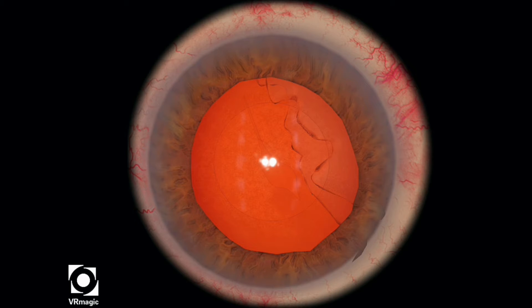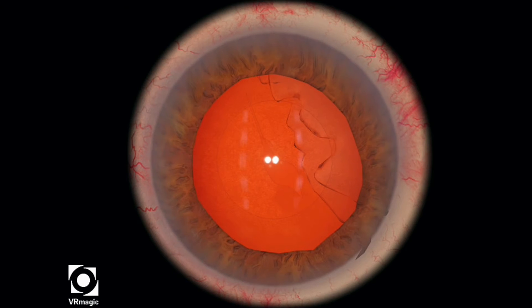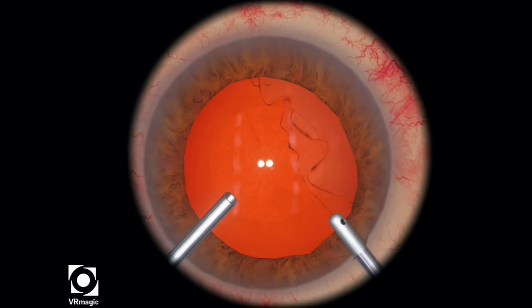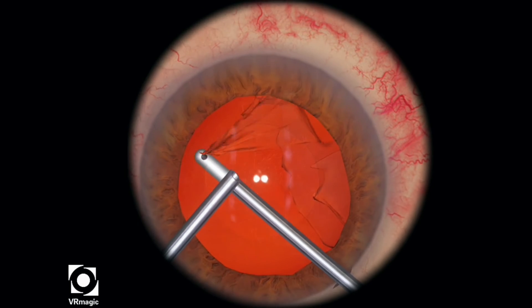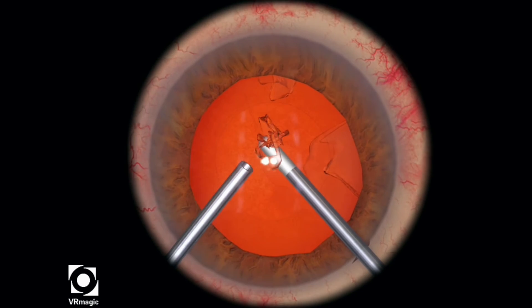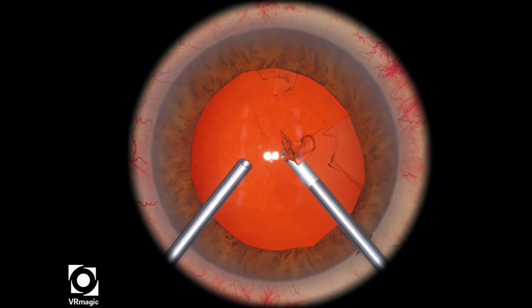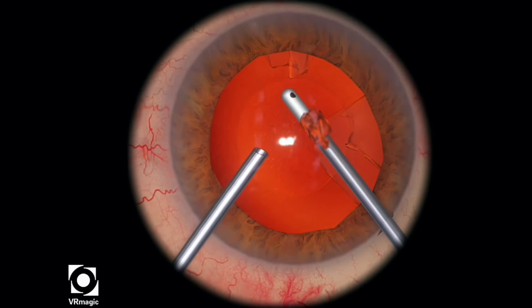Now I'm just adjusting my OR machine settings. I prefer to have a bi-manual irrigation aspiration tool for this particular level. I know in certain institutions you may not have this particular device available to you, so you can try it with a 45 degree IA tip. Now here's an important thing: you want to set your flow rate to a very, very low flow, maybe around 5 to 10, and you also want to set your bottle height to about 60 or 55.